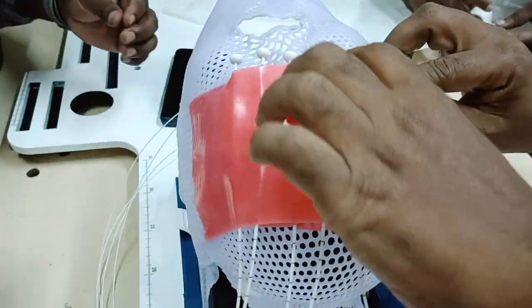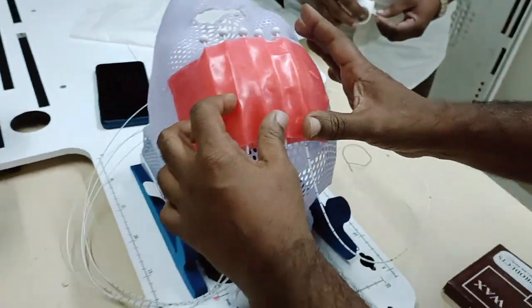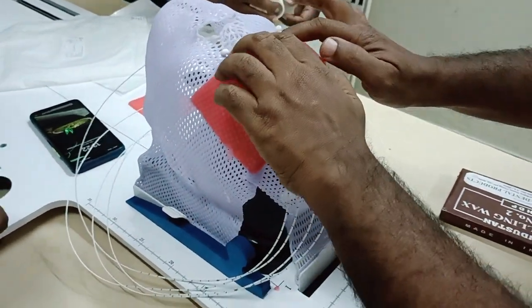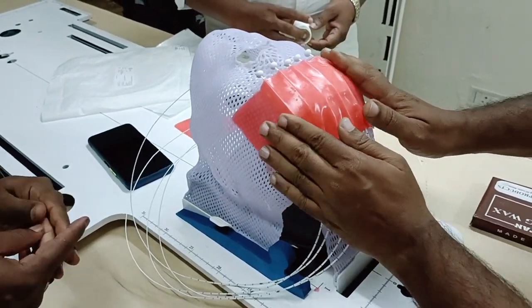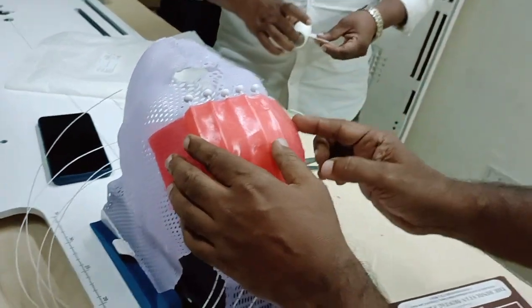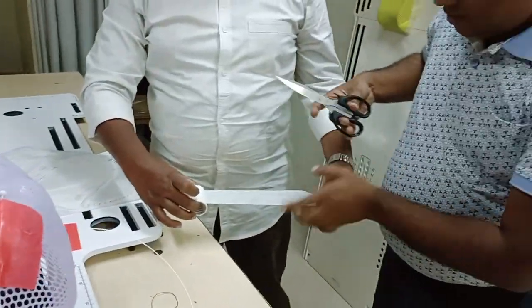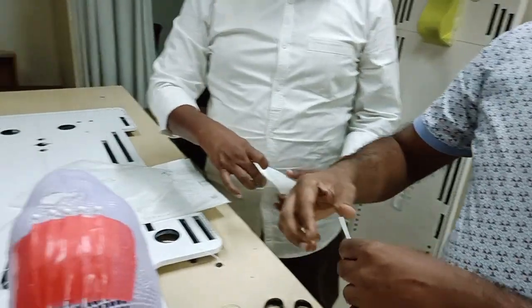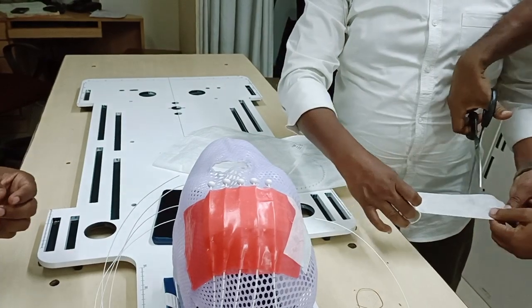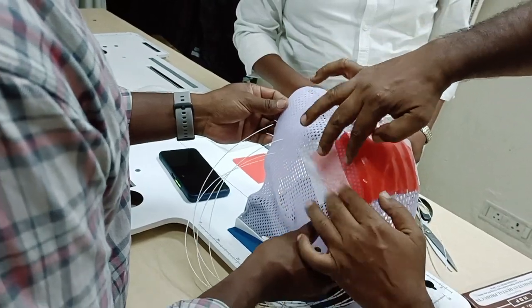It is a very easy procedure and you can do it for any site of the body. Make the mask properly according to the required size and shape — it is totally fixed to the body. After treatment sometimes the edges may come out, so just fix them with micropore along the edges for slight extra protection.